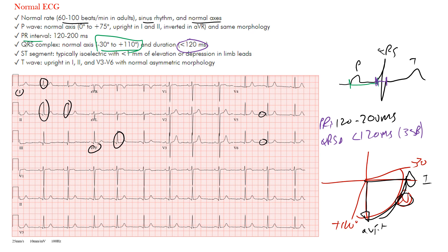The ST segments should be isoelectric or at least less than one millimeter of elevation or depression. The ST segment is at the end here — if it's elevated or depressed it shouldn't be more than one millimeter in the limb leads. Normally we don't want to see ST depression in the precordial leads. In terms of the T waves, they should be upright in those leads where the ventricular wave is heading that way — notice lead one has upright T waves and lead two as well.